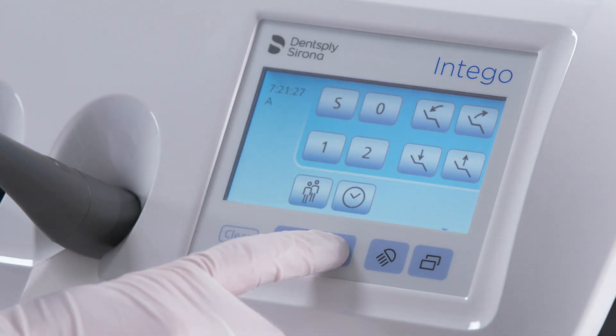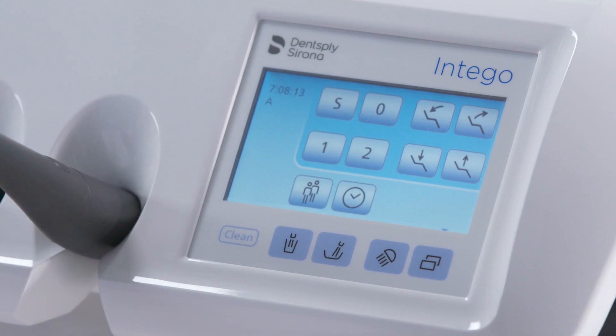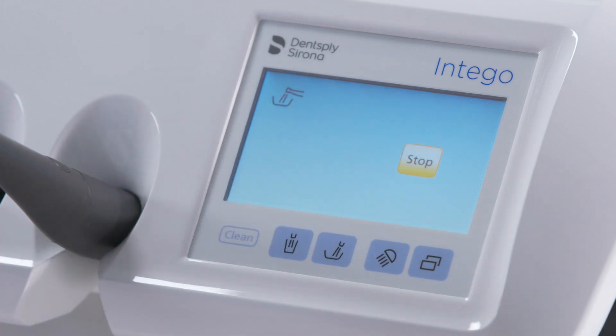Microorganisms can grow in the water lines of the treatment center. Flush the water lines by operating the cuspidor or flushing function for at least one minute. Flush the instruments using the purge function, activated in the sub-menu of the start dialog.